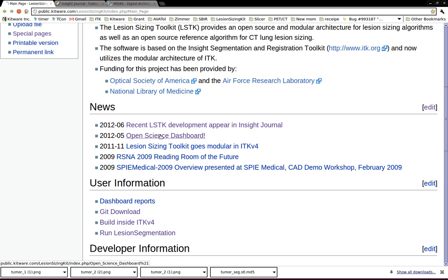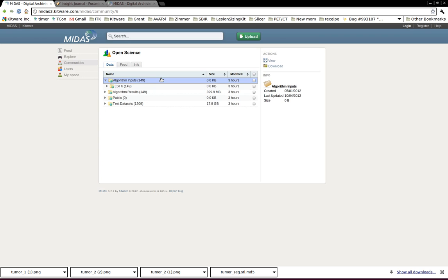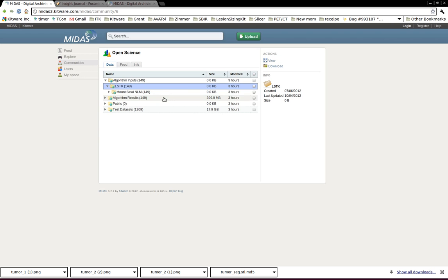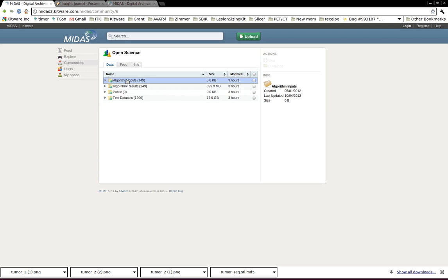We put a lot of data there. We actually ran lesion sizing segmentation on more than a hundred lung CT images here. We also provide input parameters, which is the seed point of the lesion, and the results are posted in this folder.